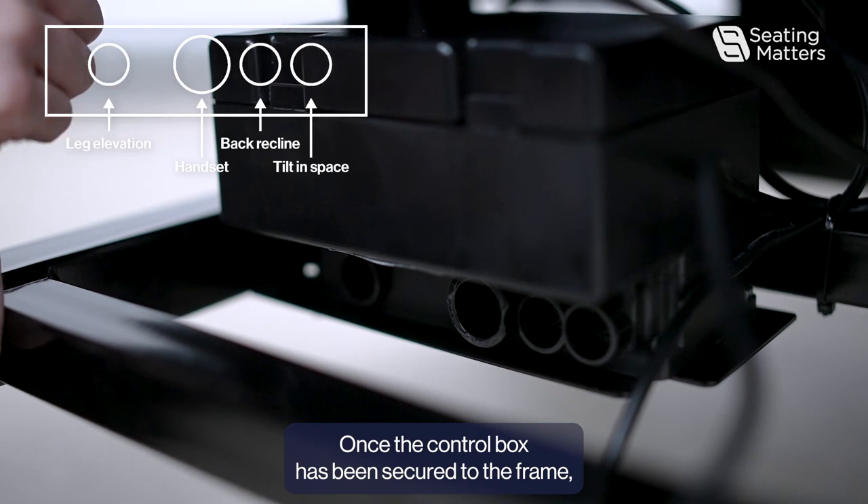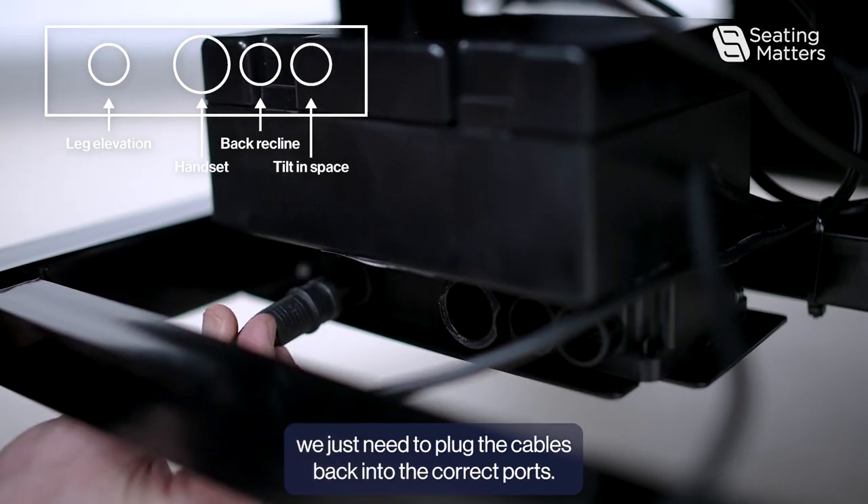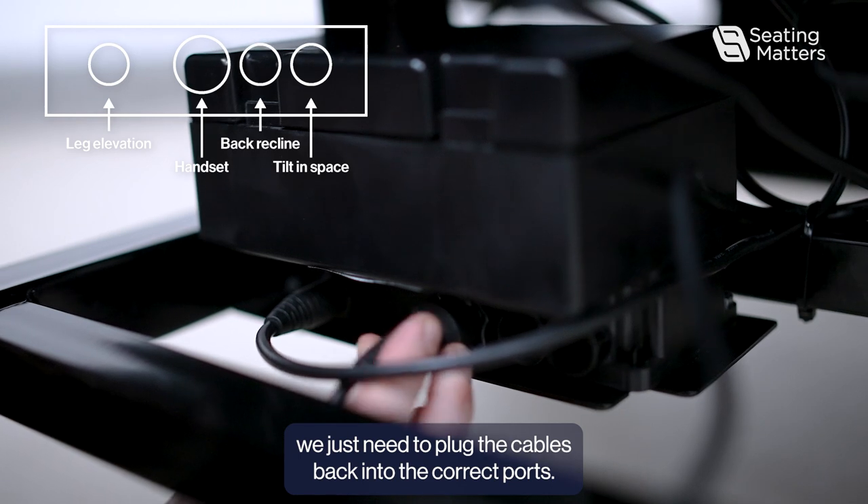Once the control box has been secured to the frame, we just need to plug the cables back into the correct connectors.